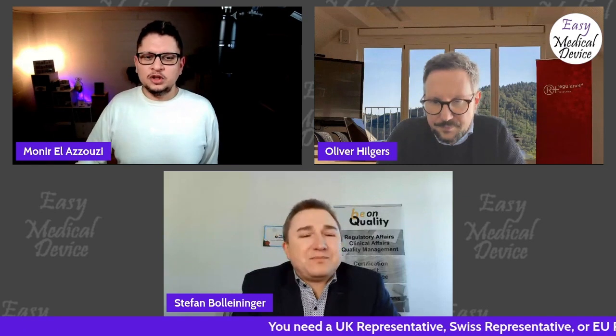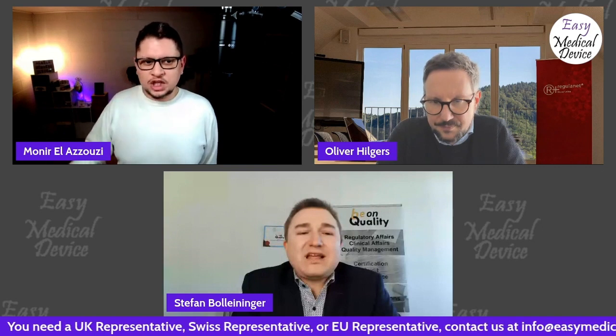Exactly, it's mandatory. According to the MDCG guidance on significant change for software, a change because of a cybersecurity threat is not considered a significant change. If you are changing because there is an issue on the market and you are updating because of a recall or whatever, then it's also not a significant change, because it's better to make this change than not to do it. You will not just say, I will not make the change, otherwise I'll go to the EU MDR and I'm not ready for it. You have to do the change anyway. There is a lot of confusion about this, so it's important to inform about that.